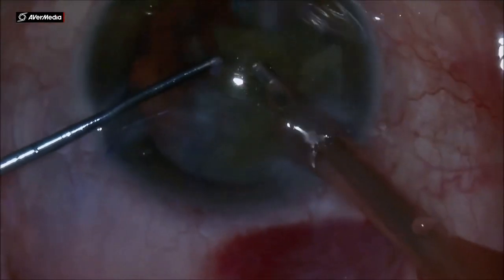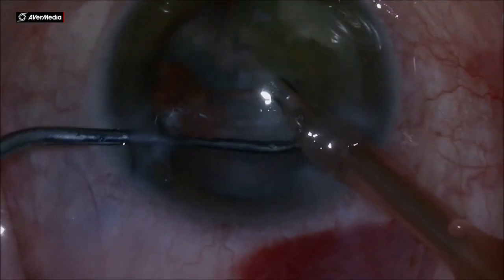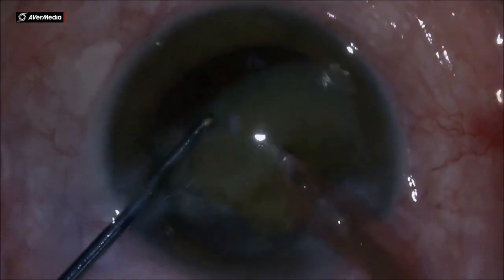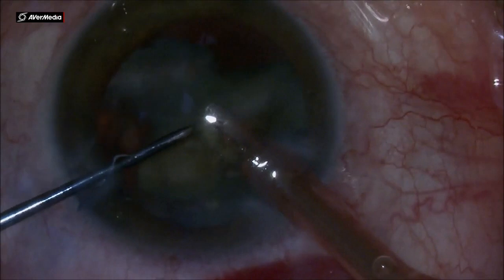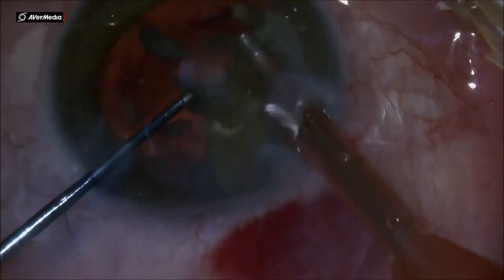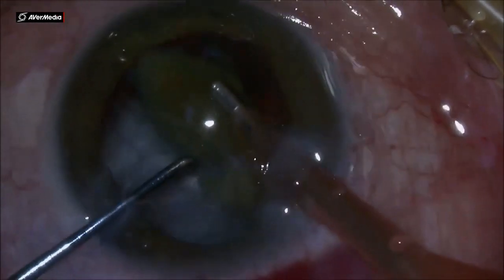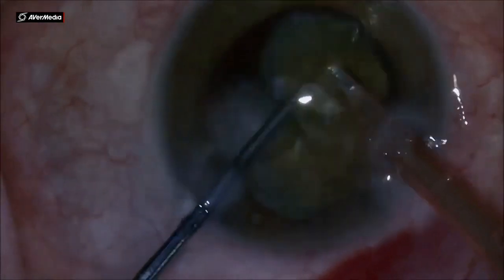And you have a stable chamber if you do this, less fluctuation, less surge into the anterior chamber. Taking the time in these cases, we don't have to rush, doing multiple chops, smaller and smaller pieces, and especially at the last part when we have the last fragments, we have no protection on the posterior capsule and nothing to hold it back, so we have to be real careful with the foot switch.